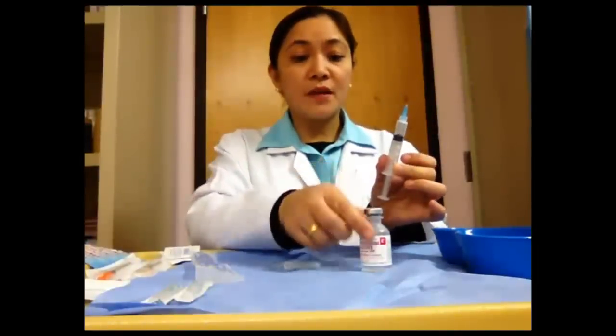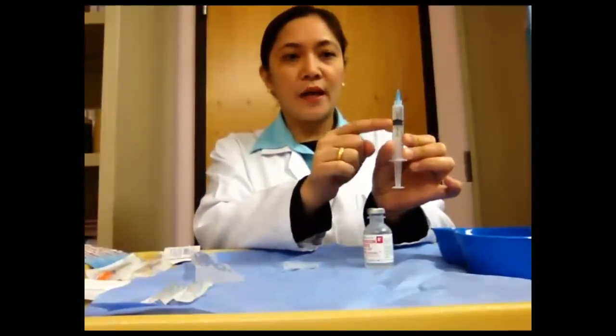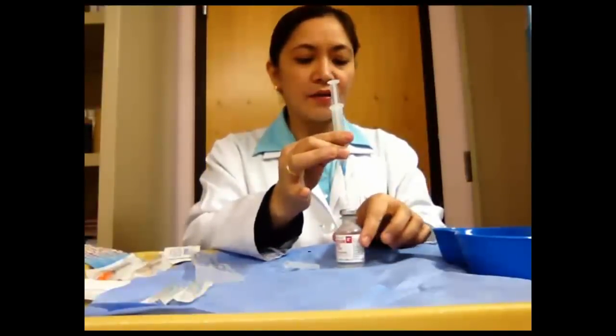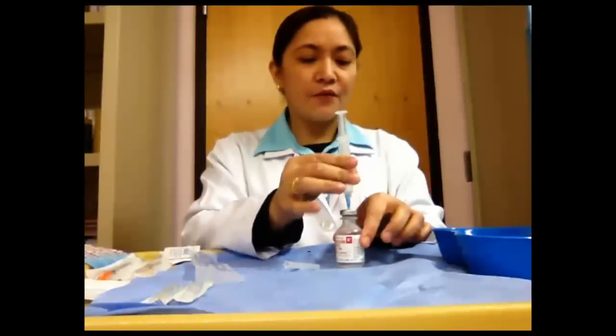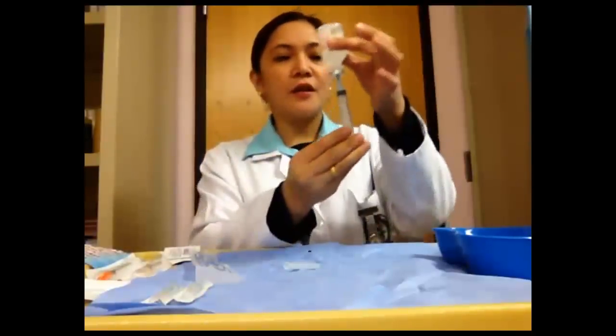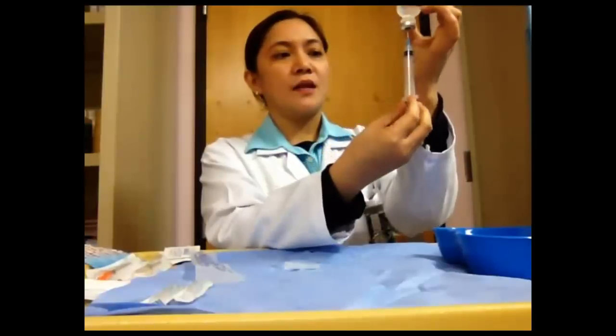Let's say we need 2 ml of this medication upon your calculation. So put 2 ml of air in your syringe, and then inject it into the vial in a vertical direction, and then invert the vial and get the 2 ml of this medication.